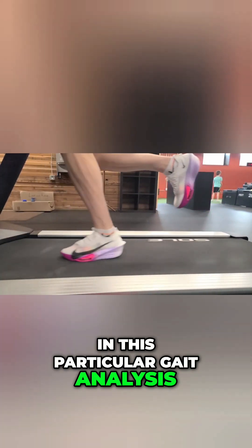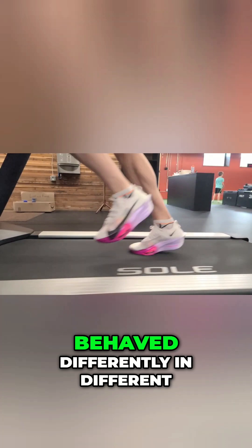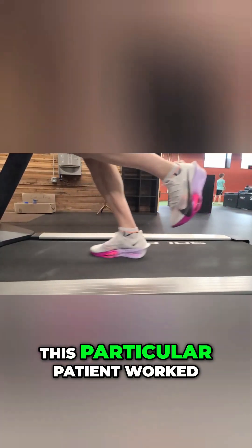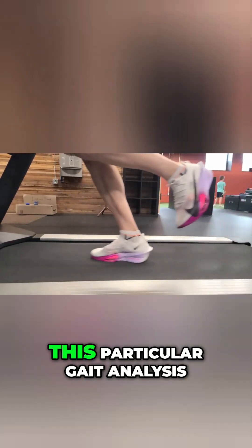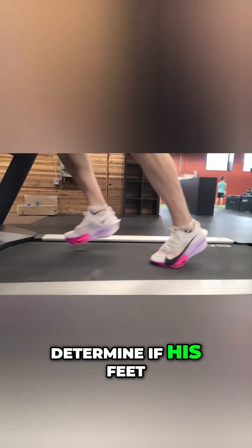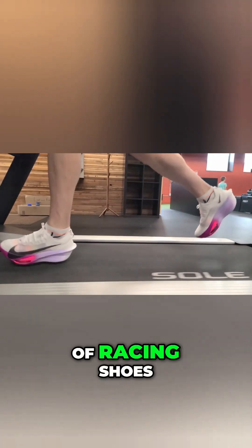In this particular gait analysis, we were attempting to find out if this runner's feet and hips behaved differently in different pairs of racing shoes. This particular patient worked through each of the phases that you just saw. Our primary goal with this particular gait analysis for him was to determine if his feet and hips were behaving differently given different pairs of racing shoes.